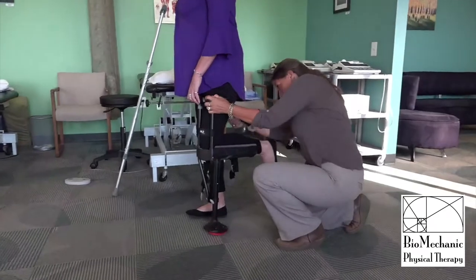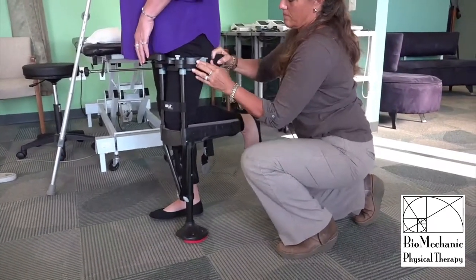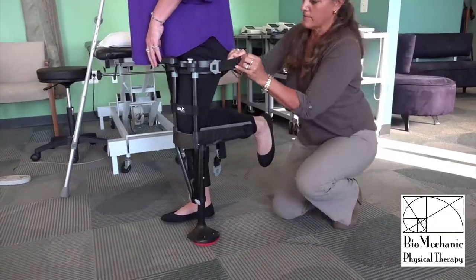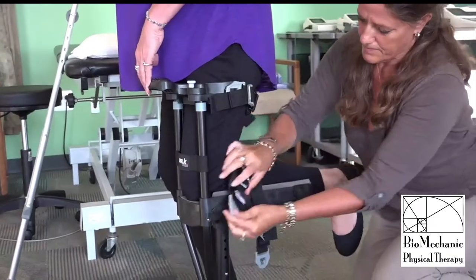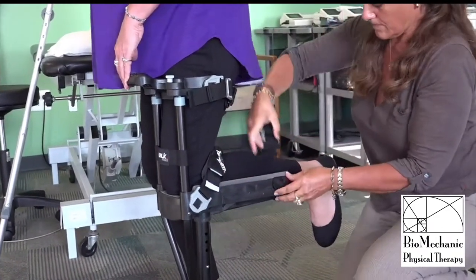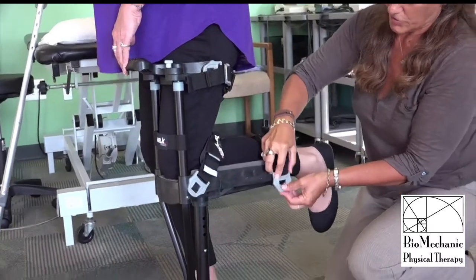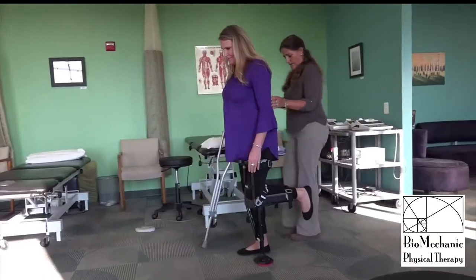So here we have Tracy putting this on for the very first time. I'm helping to strap her in. It's pretty easy — there are three straps you just clip on and tighten them down. Of course you're not always going to have somebody strap you in; you're going to want to be able to do this yourself.